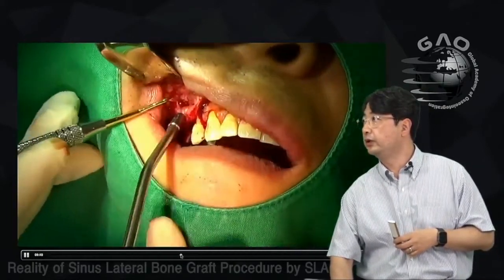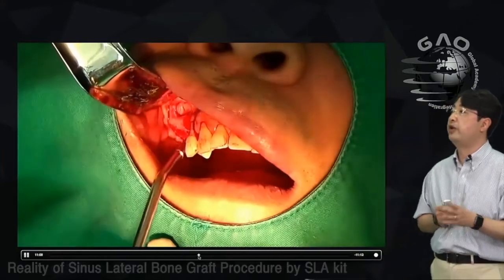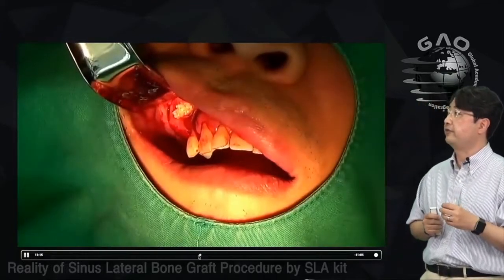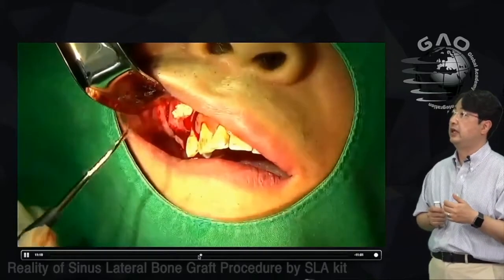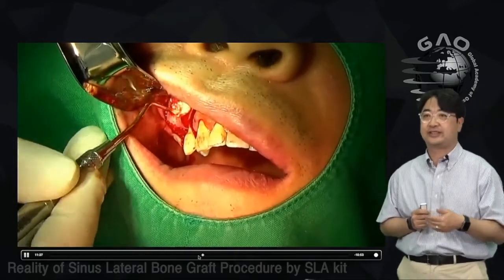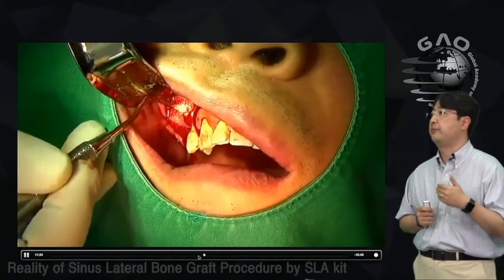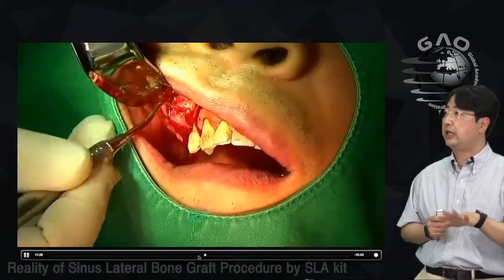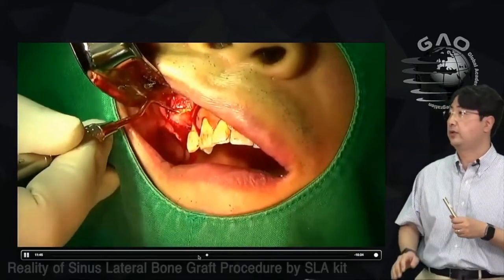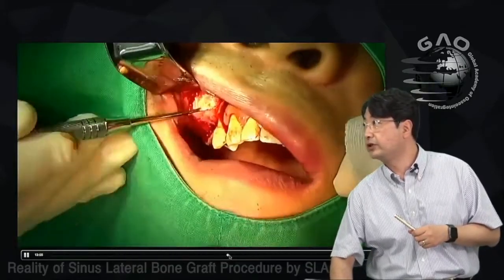Once I finish with the freer elevators, I'm ready for bone graft. I found no perforation of the membrane. I place the bone graft in a syringe, carry it to the site, and use the freer elevator to pack bone underneath the membrane to the crestal area. I do distal first, then mesial, then the middle part.